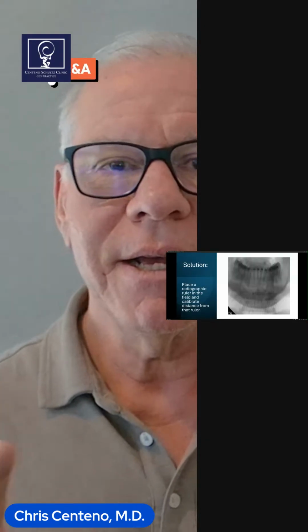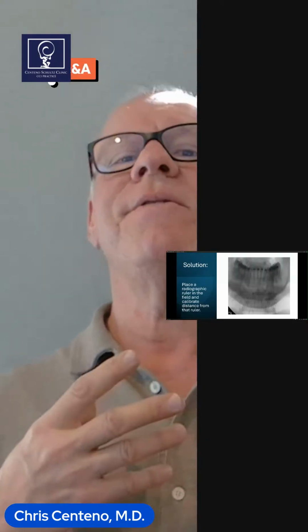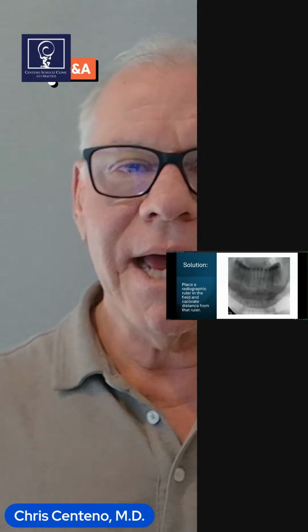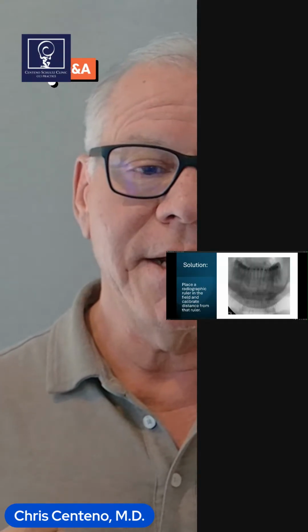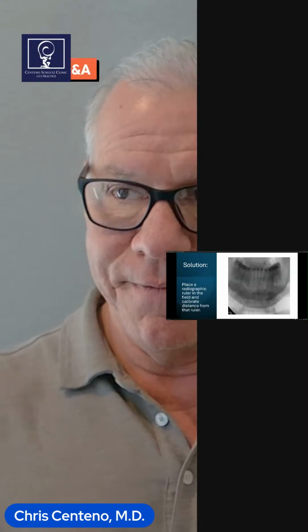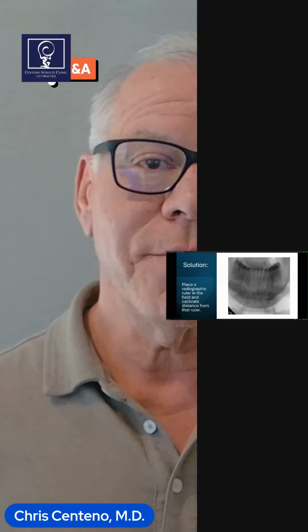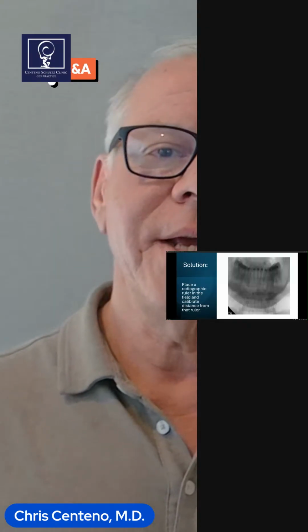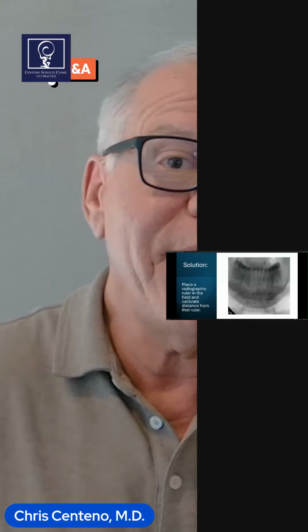Is this patient leaning too far forward? Are they leaning too far back? Doesn't make a difference at all because I can set up my software on my end to measure a centimeter on the film. And then my software would be able to say, well, this number of pixels on the image equals a centimeter. So now I don't have any of those problems.